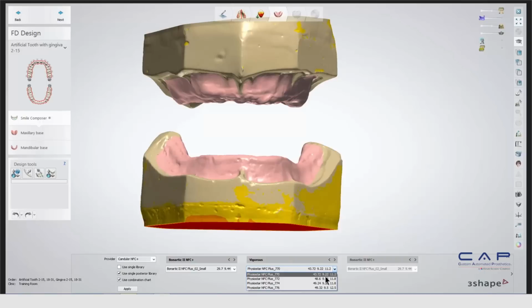Under these, you'll see the distances that are applying to the designs here. This talks about the distance of your anteriors and then the height of your anteriors over here. And I believe this is the central width as well. Yes. So those should match the individual options that you have on the cards that go back and forth. So you choose the individual card, it has the individual heights here. So you can choose your anteriors and then your posteriors as well. So we're just going to start with a delicate setup here and then hit apply to apply the changes.